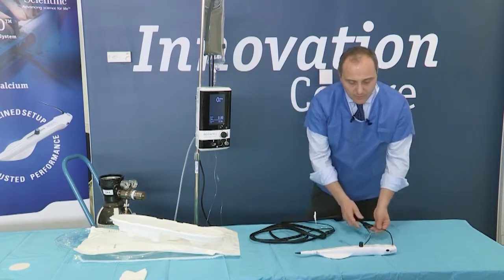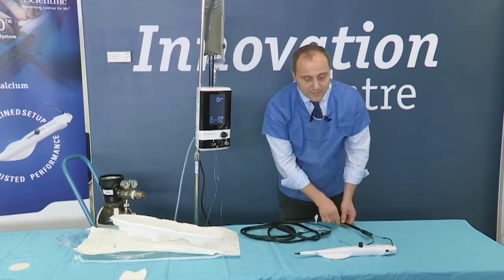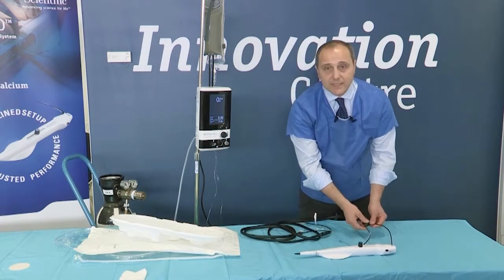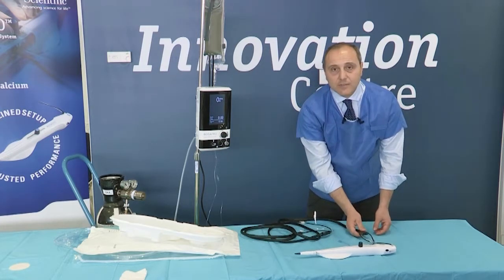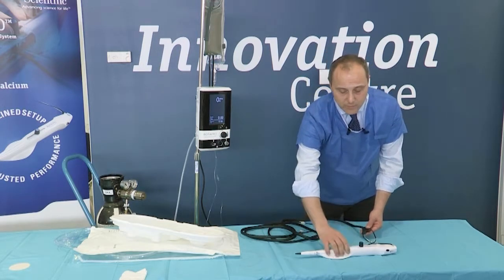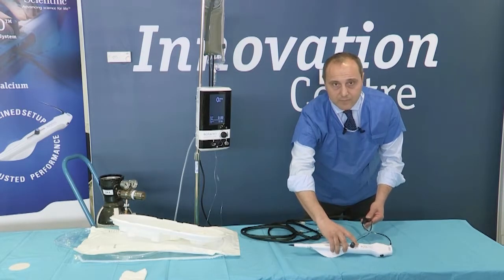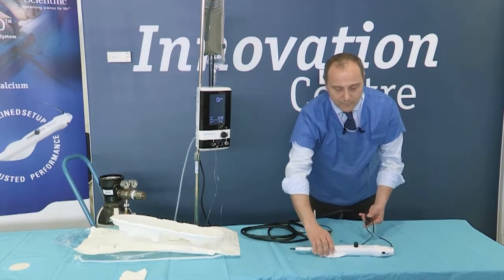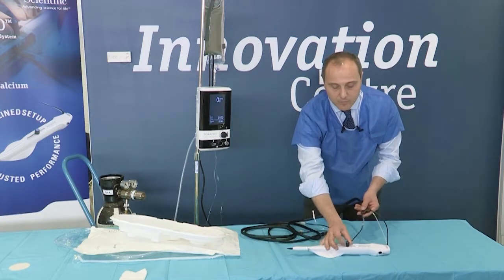Try to straighten all these cables, these plastic tubes, before starting. This will be particularly important and will facilitate the work of the operator. Try to avoid that these cables are flipped like this, because otherwise, in the very moment we start doing the rotablation, you will have trouble advancing your knob. While if these cables are unfolded, advancing the knob will be much easier.